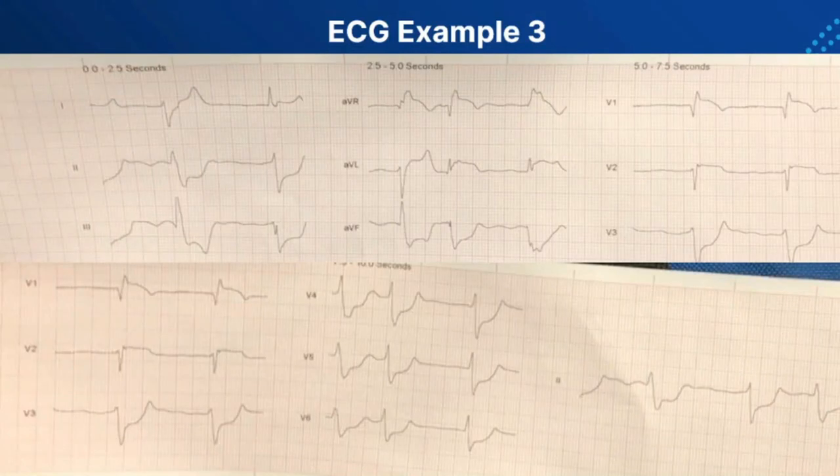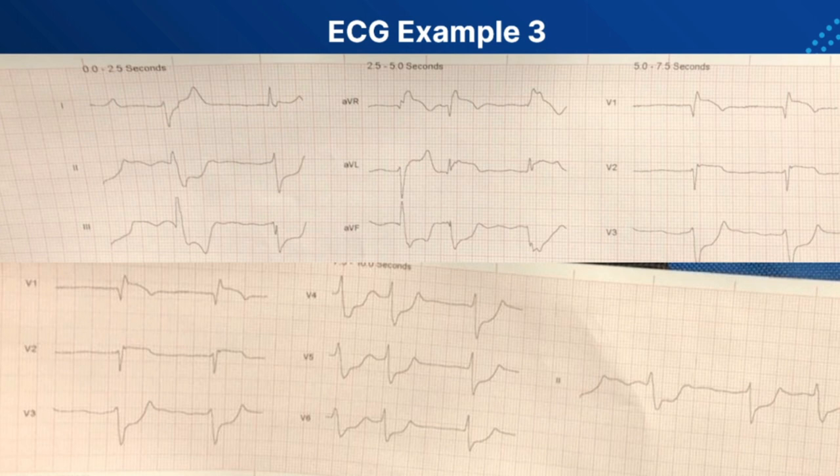ECG Case 3 is also mimicking a STEMI, but more of a lateral and septal STEMI. You've got depression in leads II, III, and aVF, a little elevation in lead I, aVL is elevated, and V1 and V2 are elevated. It looks very wide and bizarre — and that's your key with hyper-K.